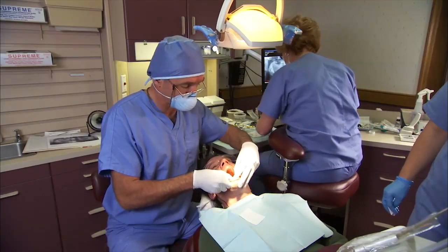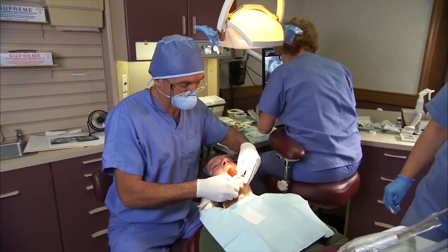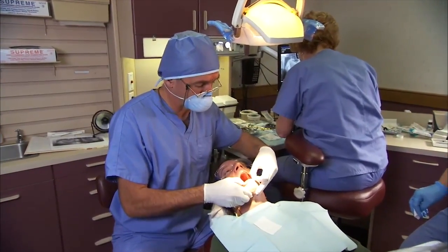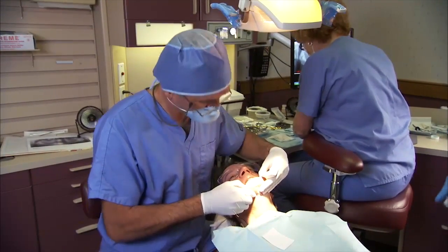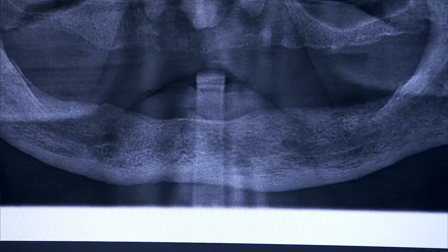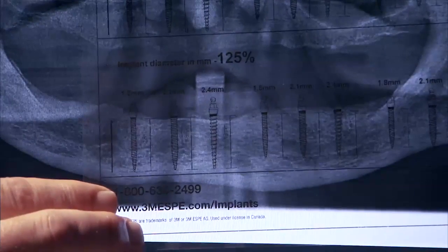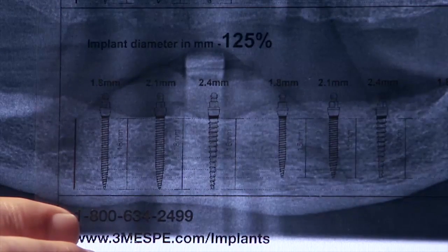Successful outcomes begin with careful case planning and a properly screened patient, including a review of the patient's medical history. Selection of proper implant size is crucial to the long-term success of the procedure. Use radiographs and the radiograph sizing transparencies provided by 3M ESPE to determine the best implant type, diameter, and length.